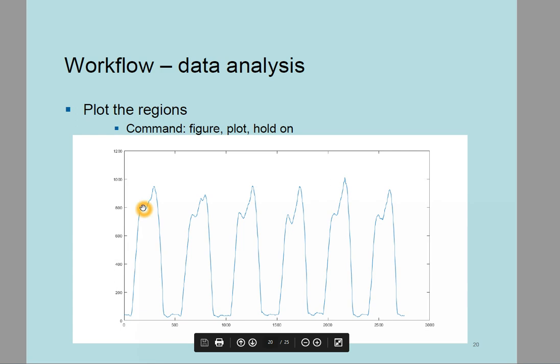So this first, the initial impact, the heel strike in this case, and then you see the forces going down during the mid stance phase, and you can see the increasing of the force during the toe off. And then in this part is the second foot in action, and then we have the same foot again striking with the heel, and so on and so on.